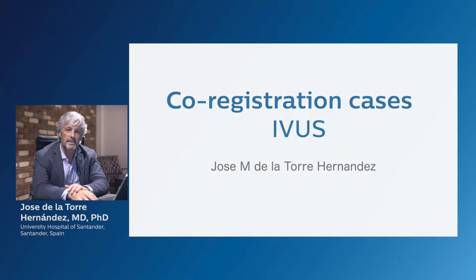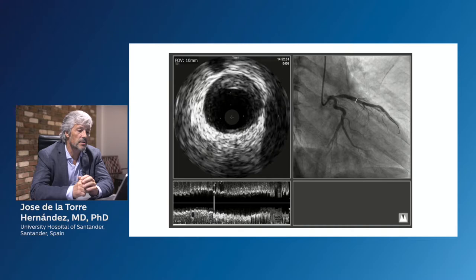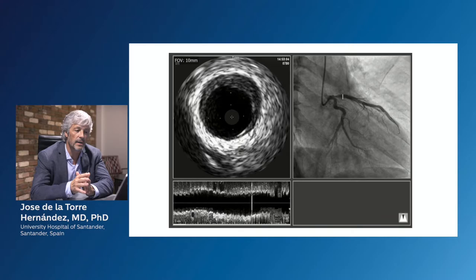The cases I'm going to show you are cases in which co-registration really added additional value for diagnostic purposes. For example, in this case, you can see an ostial lesion in the LAD, and the co-registration shows the proximal LAD and how the plaque is really growing approaching the ostium.